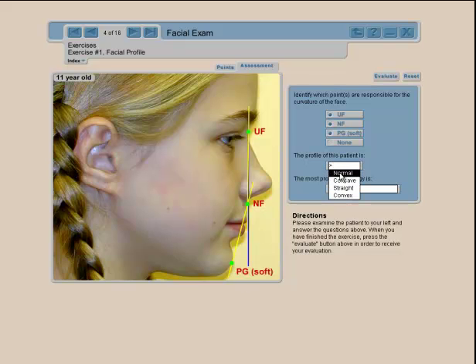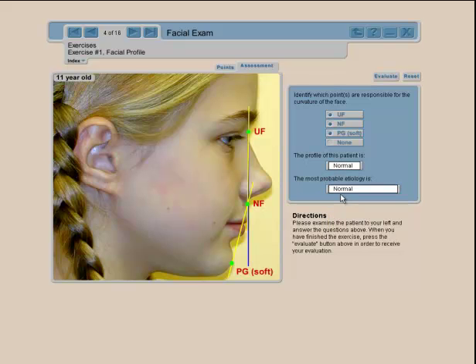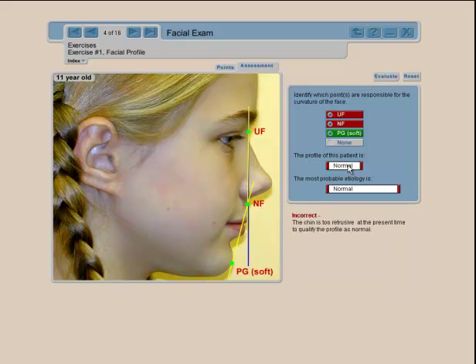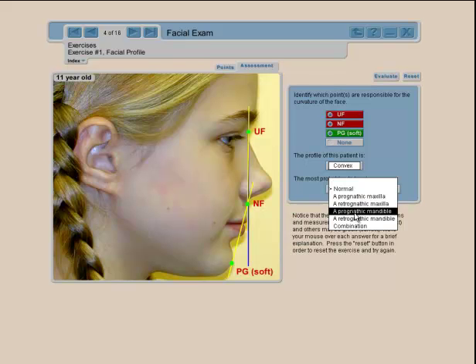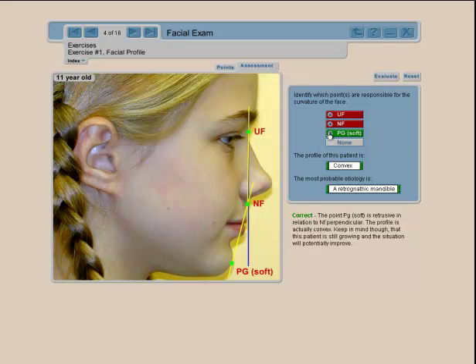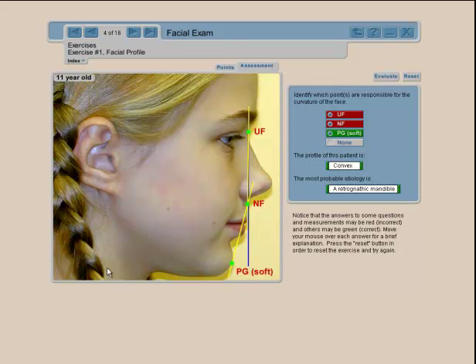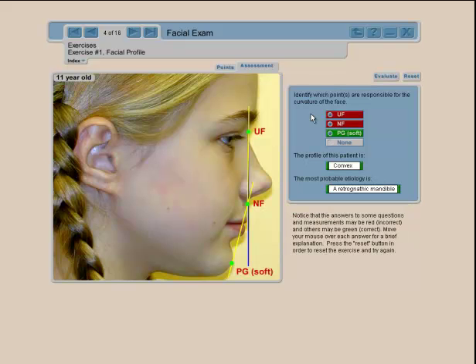You then identify the points responsible for the curvature of the face — upper UF, NF, and PG — and use the drop-down menu to indicate whether the profile is normal, convex, or straight. You evaluate yourself: if you answer incorrectly, the correct answer is shown, for example that the pogonion was responsible for the convexity. All correct and incorrect answers have feedback.